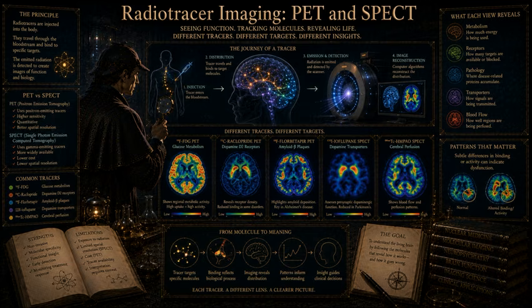Now, assuming the tracer's chemical affinity, KD, doesn't randomly change from person to person, BPND becomes directly and linearly proportional to how many receptors are physically available in that person's brain. It is a pure signal-to-noise ratio. The cars in the VIP spots, CS, are our true biological signal. The cars wandering the grass, CND, are our background noise. Precisely. We are measuring how powerfully the true signal rises above the background noise.